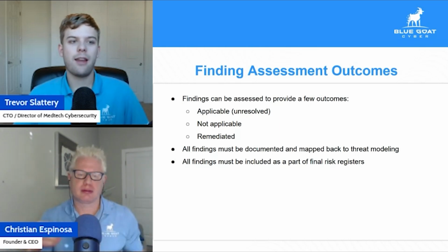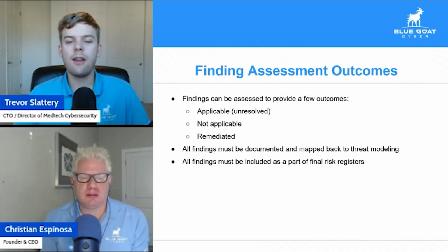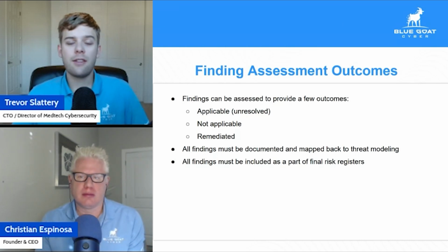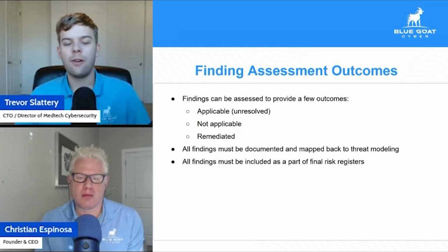It may be the case that, for example, a component of the SBOM has a vulnerability, but there's no public exploit code. Nobody knows how to really exploit the vulnerability, and so it just gets logged as an unresolved anomaly. Eventually, a security researcher develops a proof of concept exploit and publishes it on GitHub. Suddenly, this vulnerability is a big problem. Anyone who can find that device is able to exploit it just because there's public code for it now.